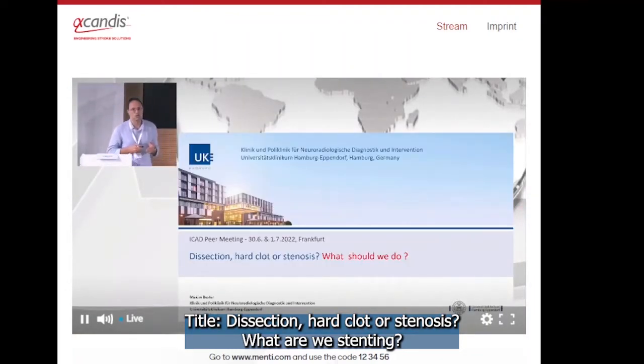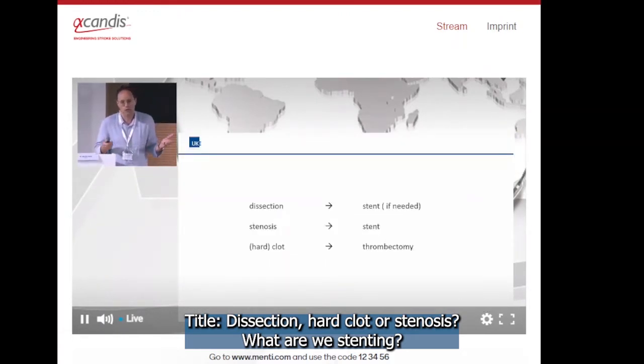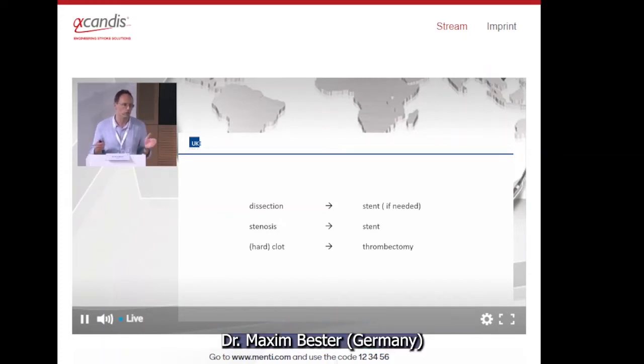So actually, when I was starting to prepare this talk, I was very happy because I thought it was a quickie. I didn't listen to Katie Katuni properly when we discussed the topic, and I thought the title is "What should we do in those instances?" And I thought, well, this is a one-slide talk. We may discuss it, but probably we all agree that in dissection we should stent only if needed, because we know it's complicated. In stenosis we probably should stent, and if there's a clot, even a hard clot, we should remove it with thrombectomy. But the question is, do we know what to do? And this is a whole different story.